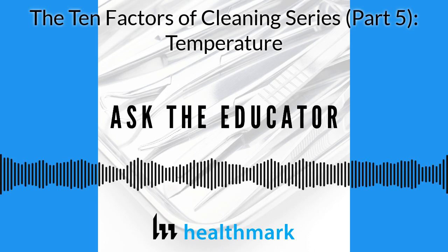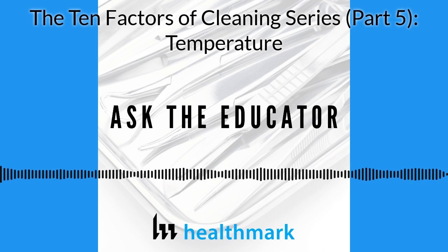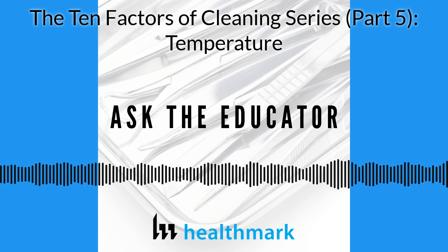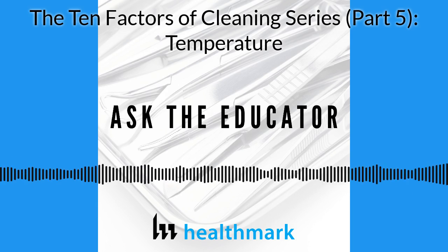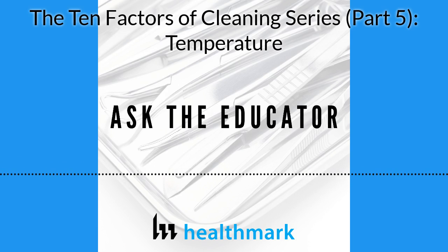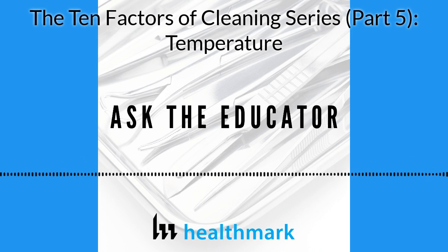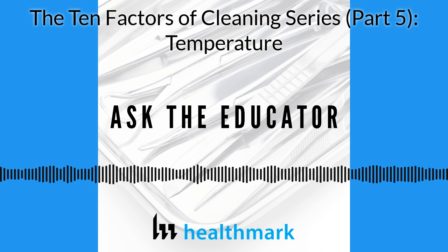And I know we're talking about temperature when we mix it, but we actually had a customer in our early days where they were renovating their sterile processing area, and maintenance moved everything. And they were actually using our Tosi, and the machine was working great, everything was passing. So during renovation, they took their cleaning solution, and he didn't know this, and they put it into the sterilizer maintenance area behind the sterilizer, where it gets 200 degrees. And if you've been back there, you know it. It's like a sauna.